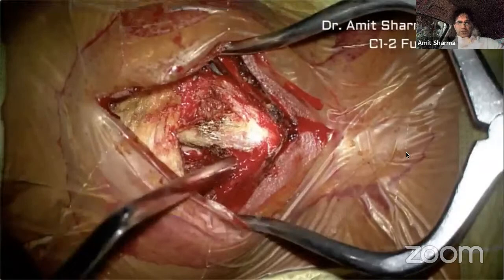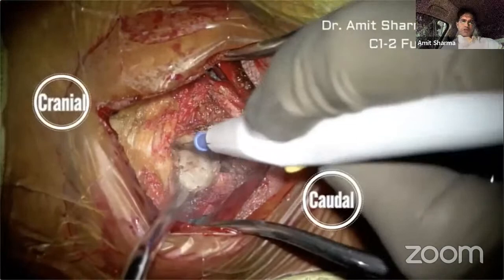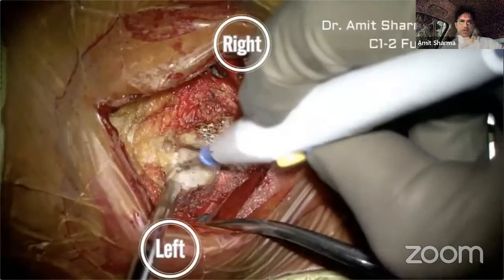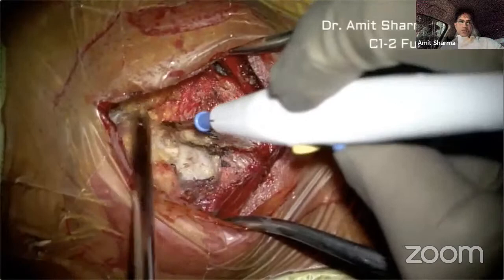you bypass all these problems. So with a standard midline incision, we expose C1 and C2. You do not have to take a very big incision for this procedure because we will be entering C1 and C2 straight from posterior. We don't need any particular angulation to pass any of the screws. I prefer to use a cautery rather than blunt dissection to prevent significant bleeding during the surgery. The muscles and the fascia are cut with the cautery in the midline and then they are dissected laterally.